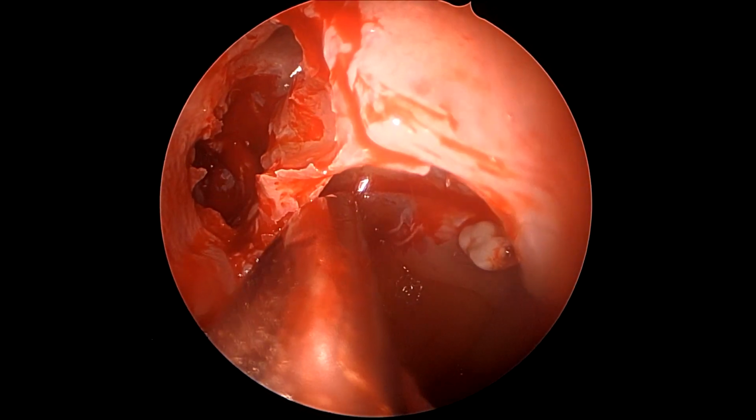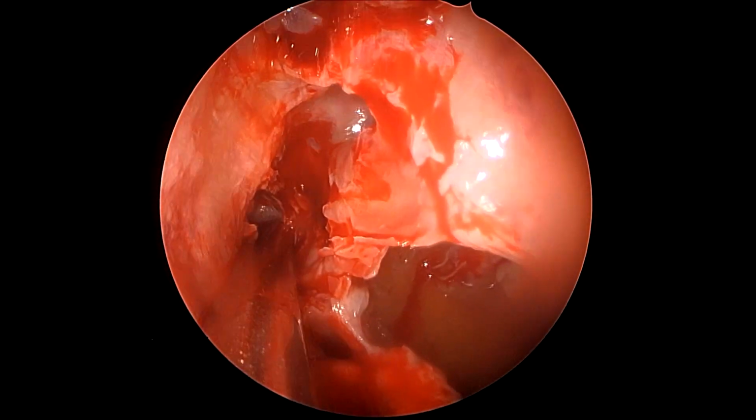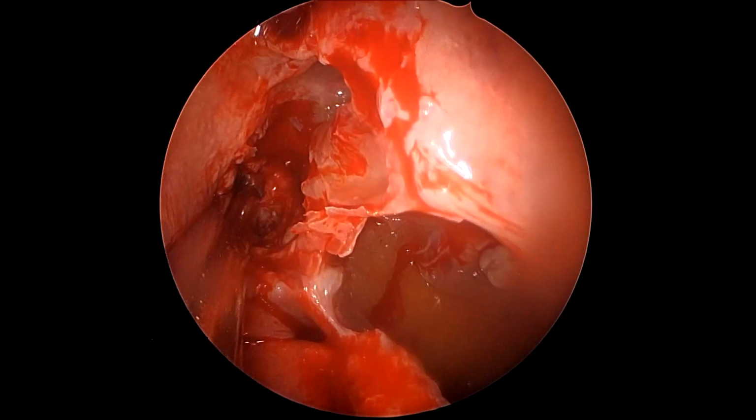This is the level of the transitional antrostomy ridge, the one that transitions between the vertical and the horizontal, and slightly above it, a fraction of a millimeter, is the horizontal antrostomy ridge, which is approximately at the same level as the sphenoid ostium.